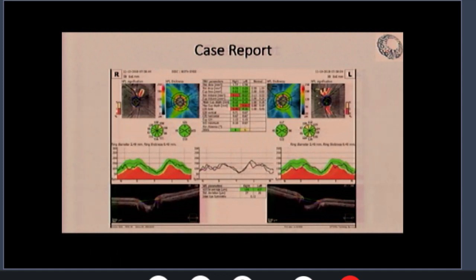And this is one step further. Which stage will you say this glaucoma is? Early, mild, or advanced? Looks like early, but I don't have enough information for the stage, because I need the visual field. That's right. That's why I didn't ask about the stage.